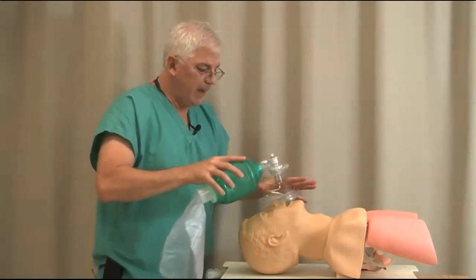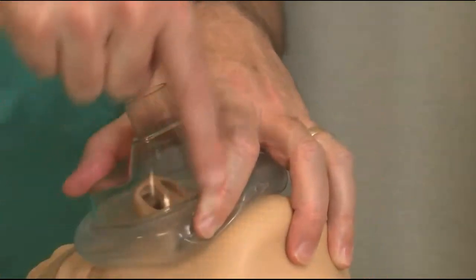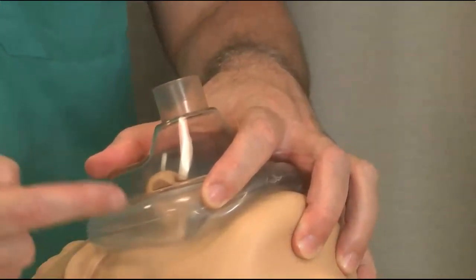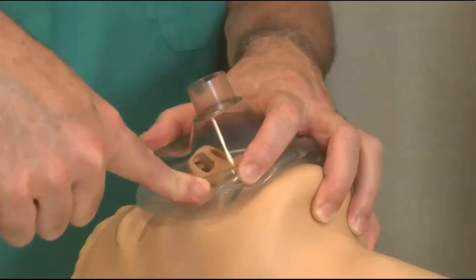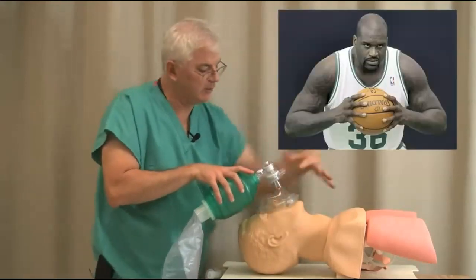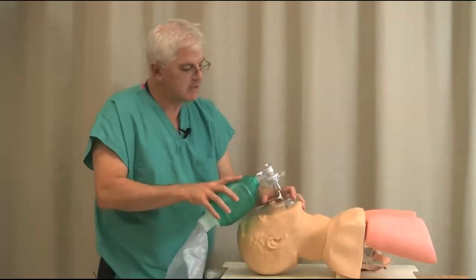My hand forms a pretty good seal on this side. It doesn't form a particularly good seal over here. So a lot of times I've had to ask people, hey, come over here, just push down here. If I had a gigantic hand, a Shaquille O'Neal hand, I could put it all the way around, but I don't. So you want to get a good seal here.